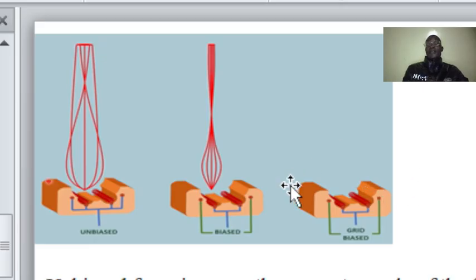So you may think that you want to produce an image, and the production of the image is better because the detector will be there to detect. Now, in the event you are doing treatment in radiotherapy, then this is so dangerous, because you may think that you have deposited some energy, whereas you have gridded all the electrons and none has reached the target, and therefore there has been no production of X-ray, which is expected to do the treatment.